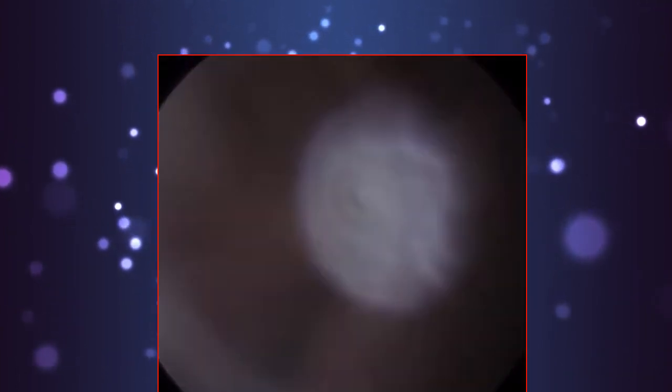So I think this is where I put some sodium bicarb drops in, and I'm going to swirl it around just so it gets to the top of the ear canal as well, where that plug of wax is. I've just gone back in. I'm trying to suction at the same time. I find sometimes when you put drops in and you suction at the same time, it has a better effect. So before we go for the wax plug, I'm just being careful to suction any excess oil and drops.